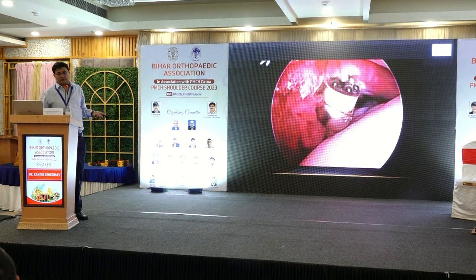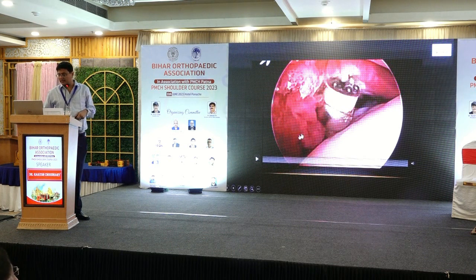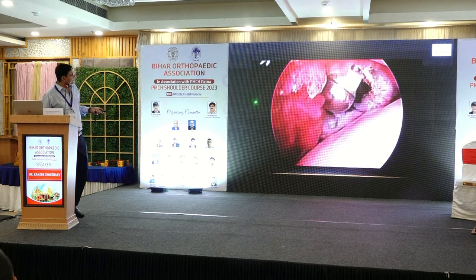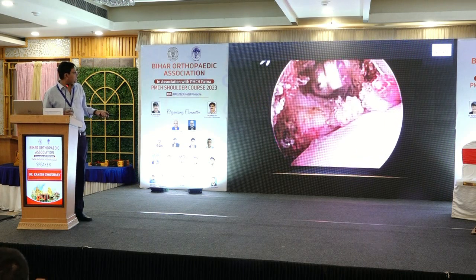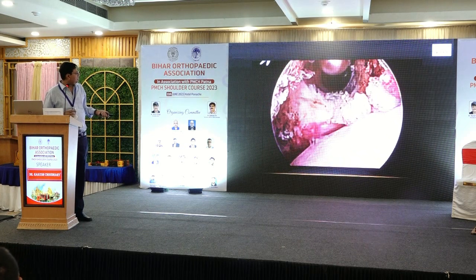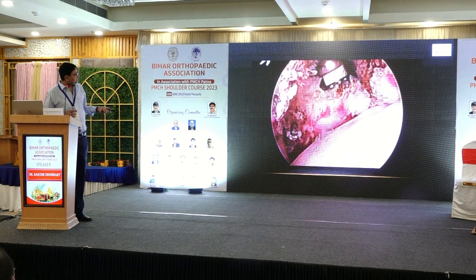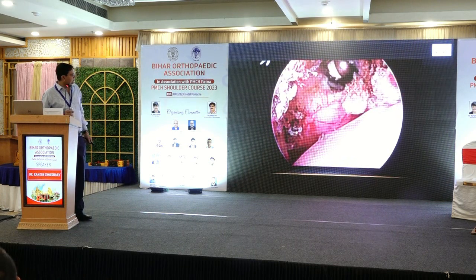This is the case of a frozen shoulder, where you have a very tight joint, so even the fluid is less. High synovial thickening causes problems in your visualization. So you start, and you can see we remove it with this band here.